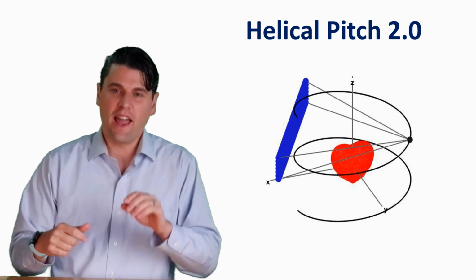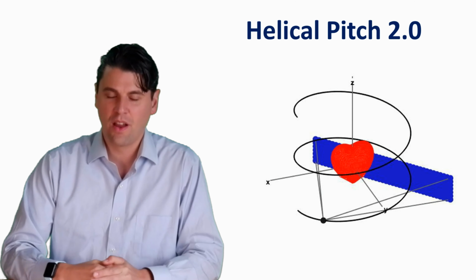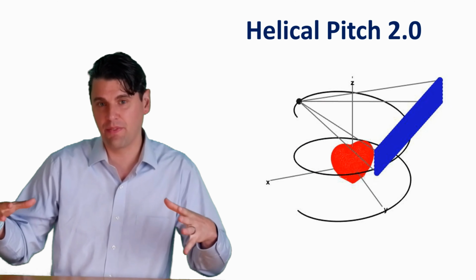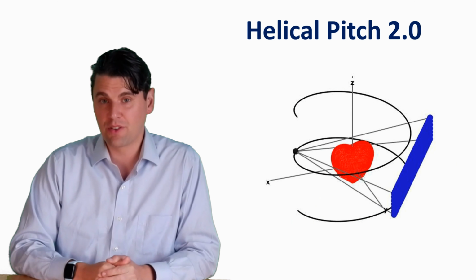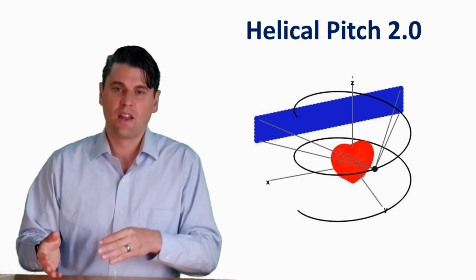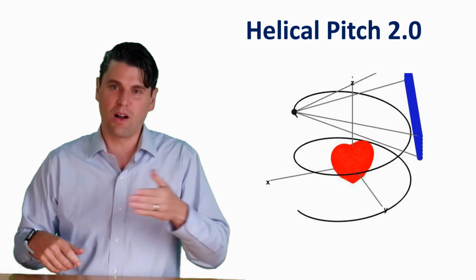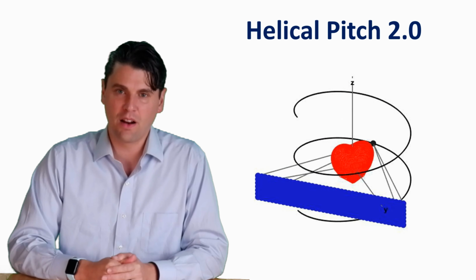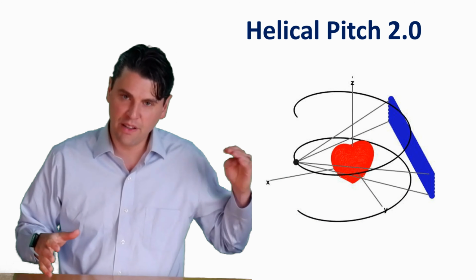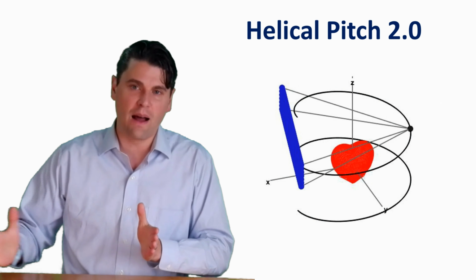In this case, at the isocenter, we just have enough sampling to make an image, but if we go further out in our display field of view, we actually would start to get artifacts in our imaging if we use a helical pitch of 2, for instance. There are also values that you can do intermediate to pitch 1 and pitch 2, but these are just the limits that I'm talking about here. The reason to do higher pitch scanning is just to cover the object more quickly.